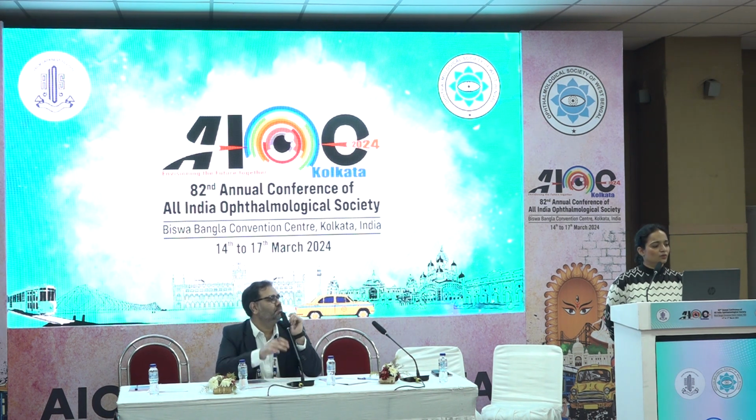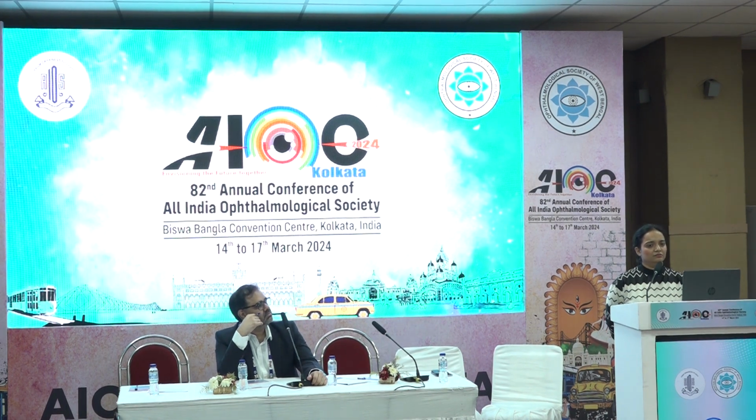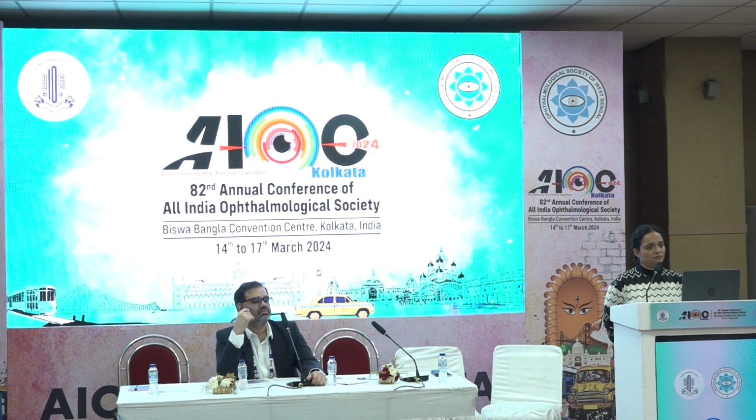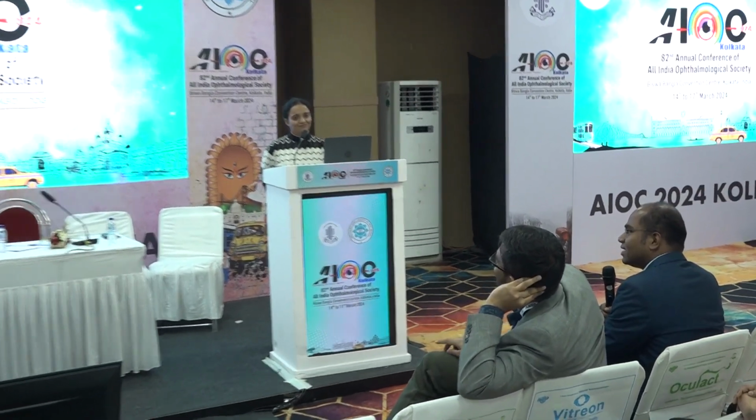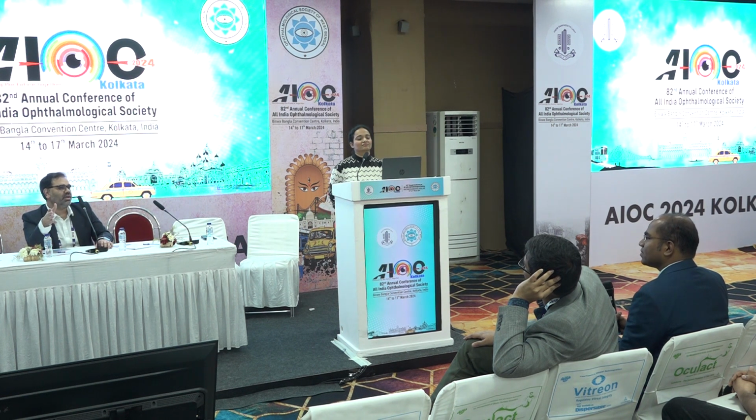Looking at the B scan, would you have considered PFV? No, we do get these pleasant surprises. I agree with you, at least two cases. The problem is that we don't do the ultrasounds ourselves. We sometimes just see the reports, and at that time we think it's more of an RD. If we do our own ultrasounds, sometimes we may pick it up as PFV and not RD.